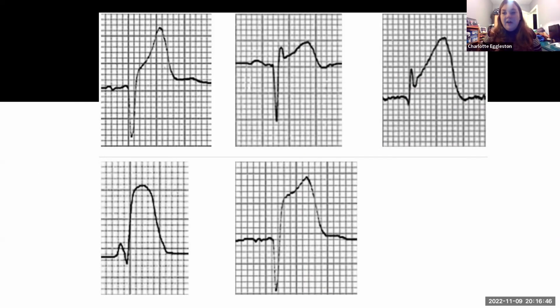Because obviously, in real life, patients don't sit perfectly still. The ECGs are a bit wibbly wobbly, so I always just check that it's kind of along the same line. You can see some of these are more dramatic than others.